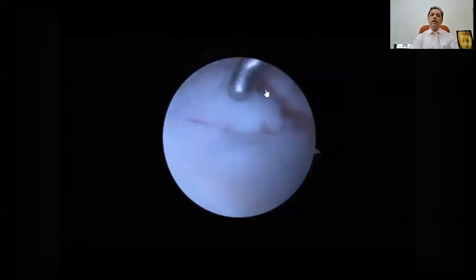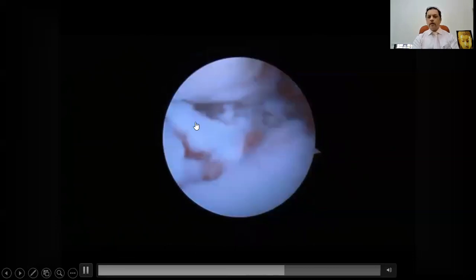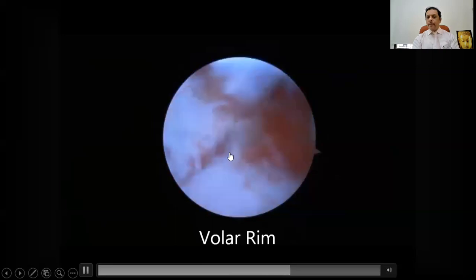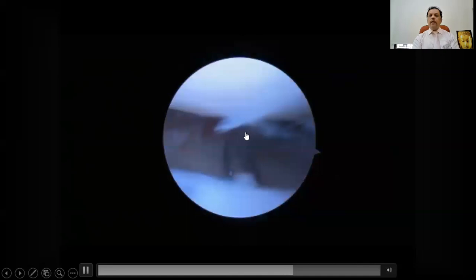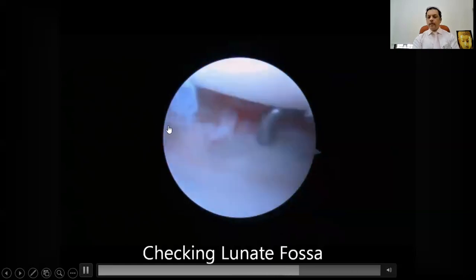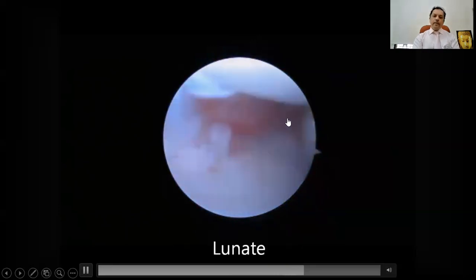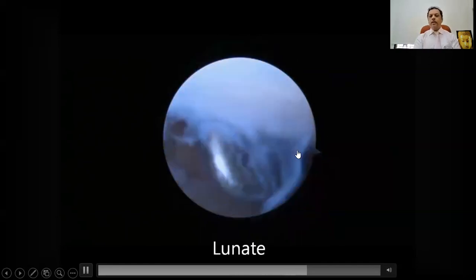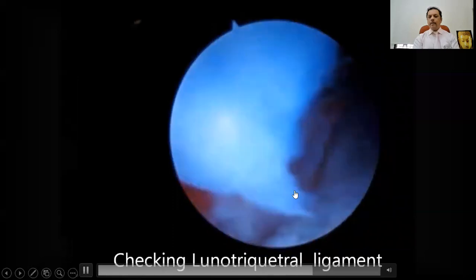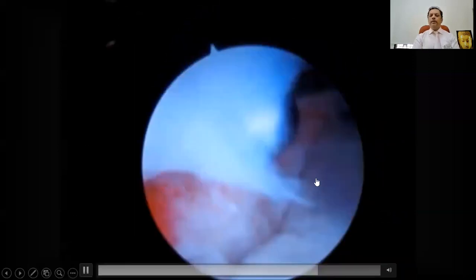Then you have the volar fragment, which we saw — it is now supported by the plate. You can see the volar rim: we have provisionally put a plate there with absolutely no gap and no step. That's what you need to confirm at this point. Then you start looking for the ligaments also. On the lunate fossa — this is the lunate, that was the radius — the lunate facet looks fine. Then you check the lunotriquetral ligaments. If there are small flap tears, you can leave them alone, or since you're there, you can shave them off. This is the LT ligament with a small flap tear — you can trim it off with basket forceps or a shaver.